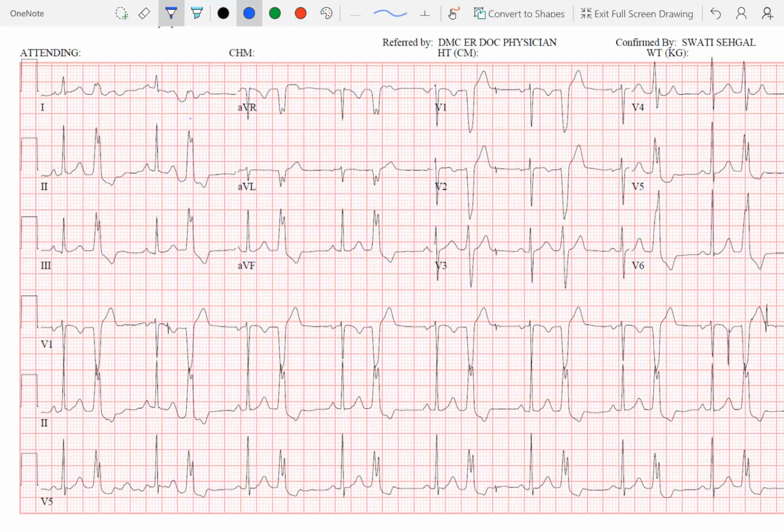So I think the first thing you should do is clearly look for any hidden P waves that you can see. If you can see any funny looking T waves that might be hiding a P wave, and sometimes it's hard and it's not very obvious that there are any P waves here. So are there particular leads that you focus on to try and see that? Well, you look at all the leads and look at the T waves to see if they are funny looking T waves, like unusually tall and spiky, which may be suggesting that they're hiding a P wave. Mm-hmm. So you don't distinctly see that, and then you see this wide QRS, right? Mm-hmm.